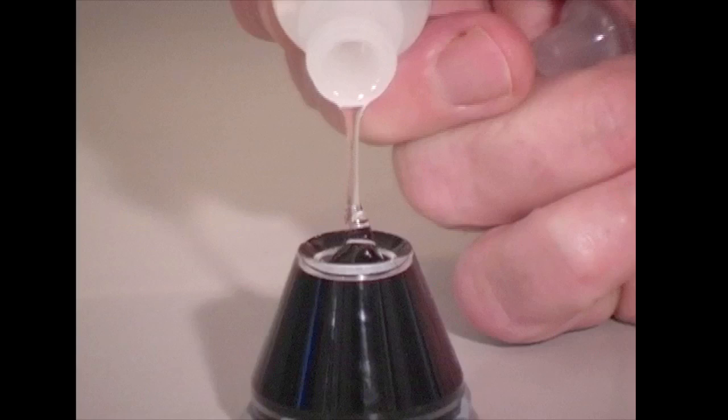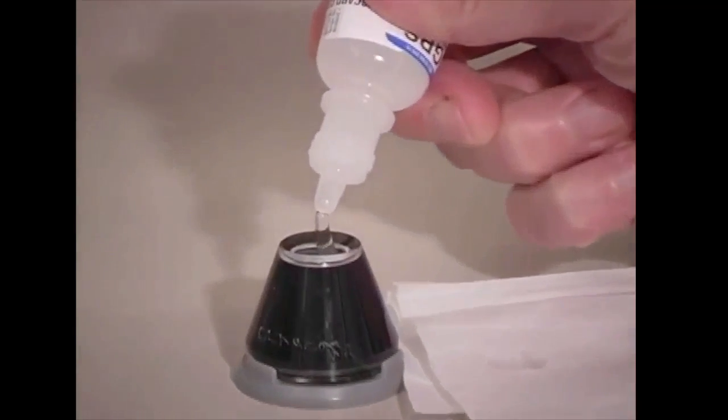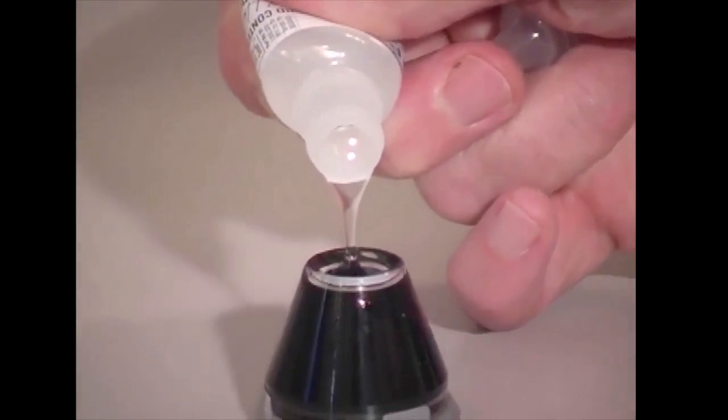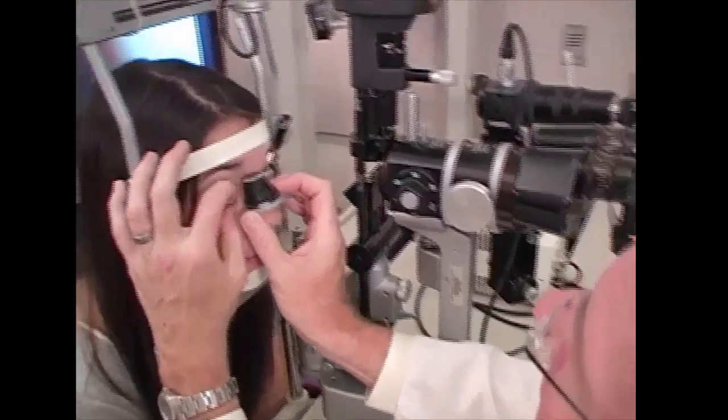Goldmann-style lens, one needs to use a coupling solution, usually methyl cellulose. So it's important that that's done without bubbles. I can either start the methyl cellulose stream on a tissue and transfer it over, or I can break the tip out and just dump the methyl cellulose into the concavity of this lens. Both of those work pretty well.